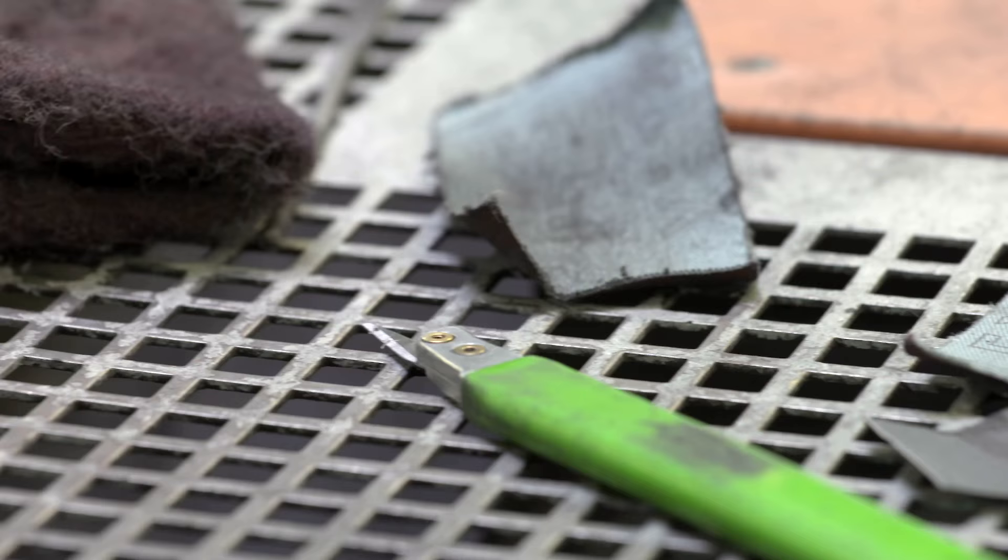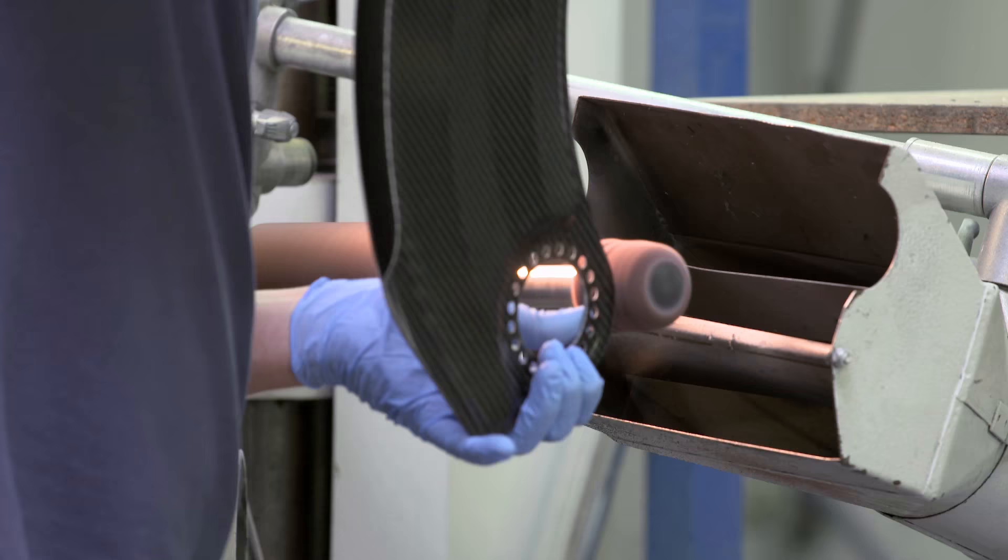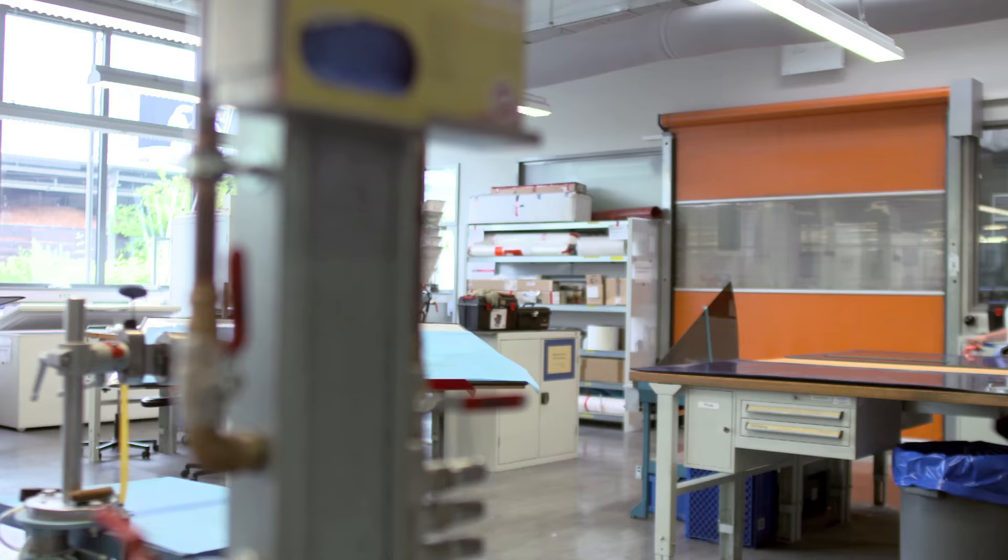All of Popov's equipment is supplied by a world-leading operation known for their innovation in the world of prosthetics. At their headquarters in Duderstadt, every running blade or spring is made by hand using carbon fiber reinforced plastic.